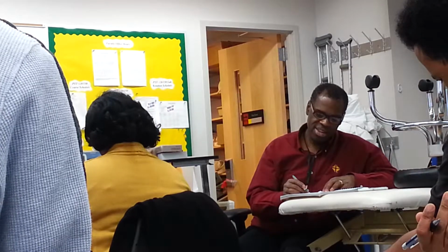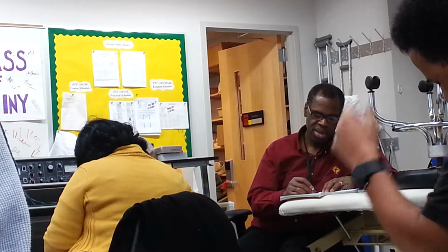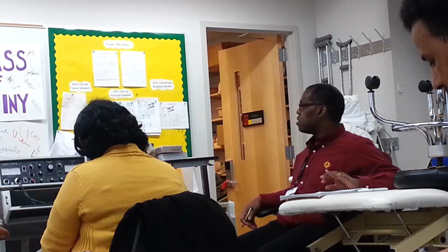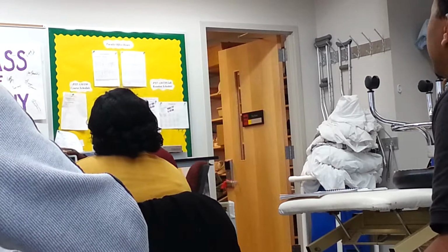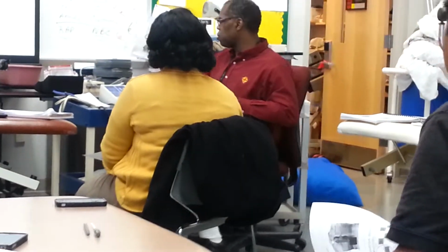All right, so the machine has continuous bidirectional, both directions, uninterrupted particles representing a zero net charge alternating current. It excites peripheral nerve without charge accumulation. Best used for motor protocols. Now, I'm getting ready to do tricep weakness. I see this machine. I can't grab it. It's not the right machine because it's a monophasic machine. So that's not the machine I want. I want a biphasic machine because if I go to the next page, how do I know it's a biphasic machine? It has at least two or more intensity channels.